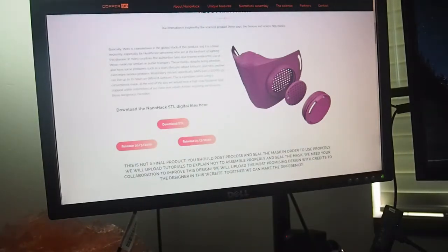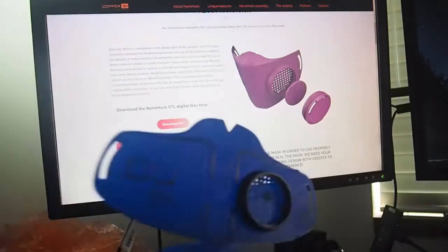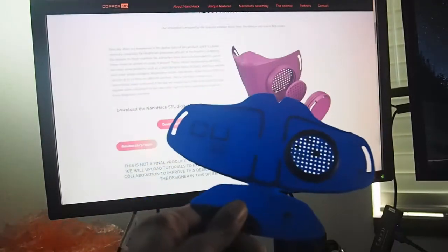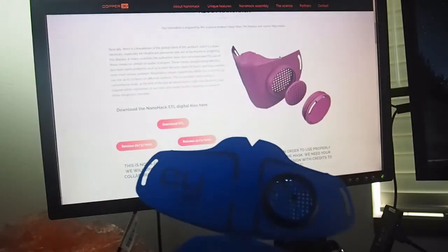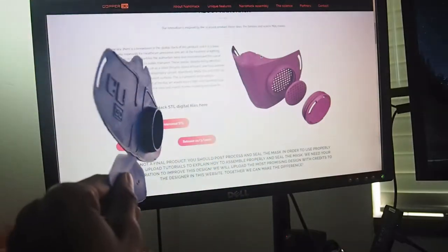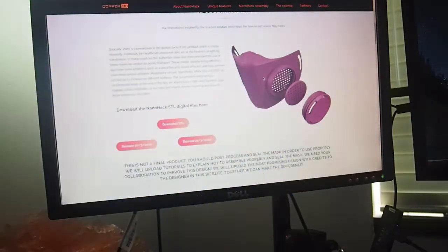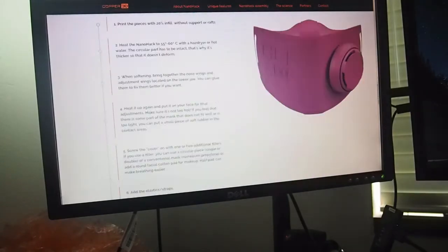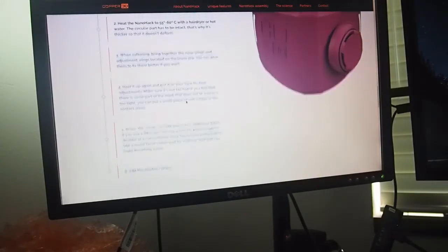Alright, so how do we achieve that? Well, it's pretty simple. We 3D print it. So I've already printed one here. We're going to go from start to finish again with this design. That's the design up here, the version 5, I believe. Here's one of my finished version 5 prints. And then basically what you're going to do is download this and follow these 1 through 6 steps.